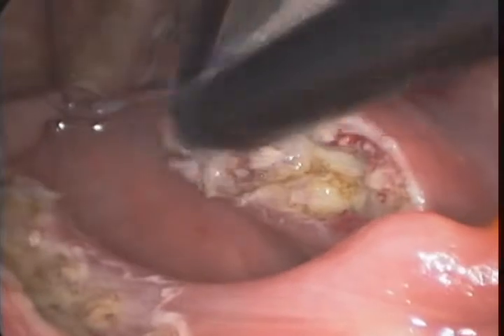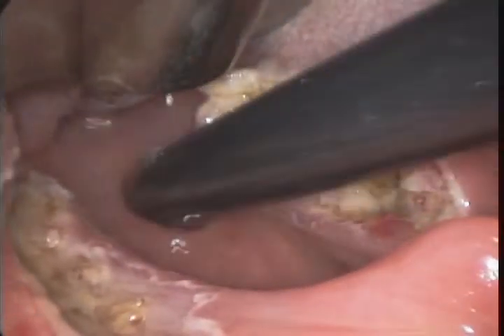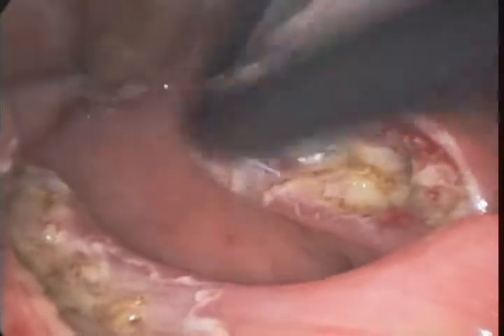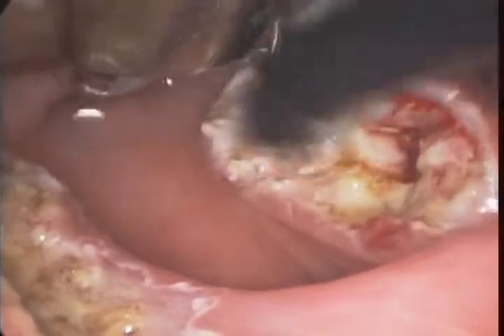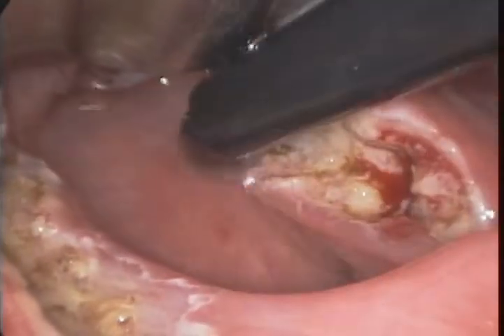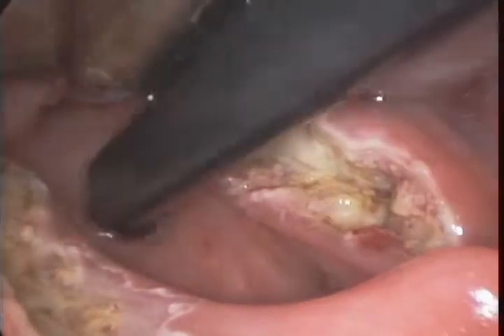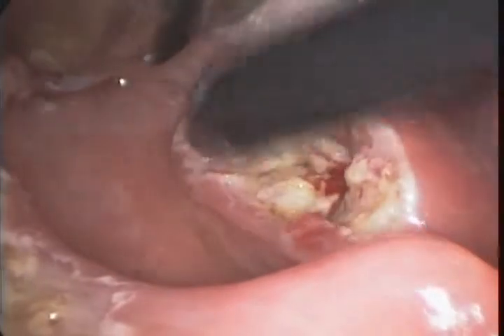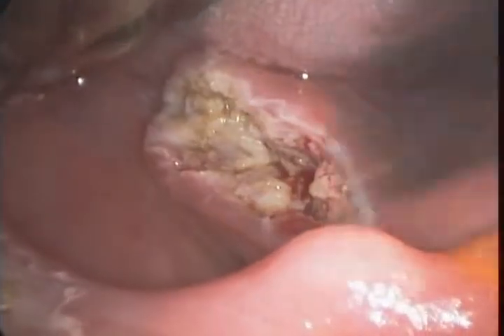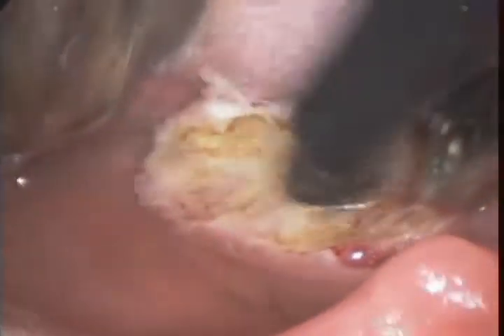And the reason for that is it takes a certain level of experience before you can visualize where the capsule should be on each patient. And it's very easy to leave a lot more tonsil than you want to leave behind if you're not aware of where the capsule is. For a surgeon who's already experienced with tonsillectomy, who's done many tonsillectomies the old traditional way, that shouldn't be a problem.